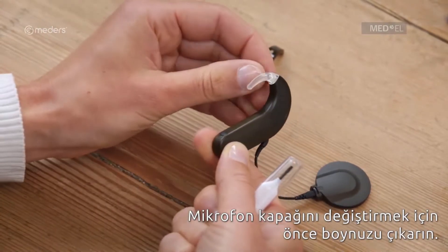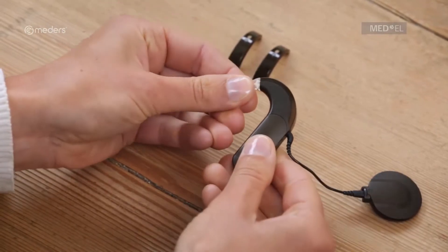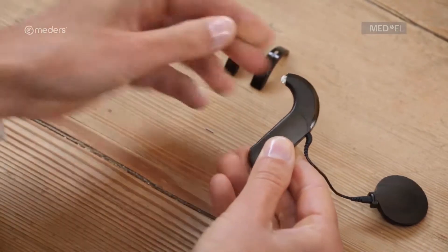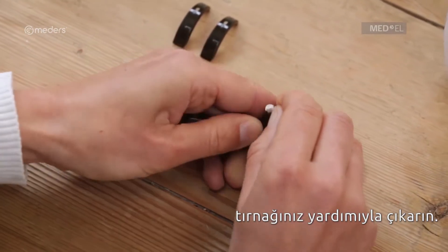To replace the microphone cover, remove the ear hook. Pull the microphone cover off the control unit from the front using your fingernail.